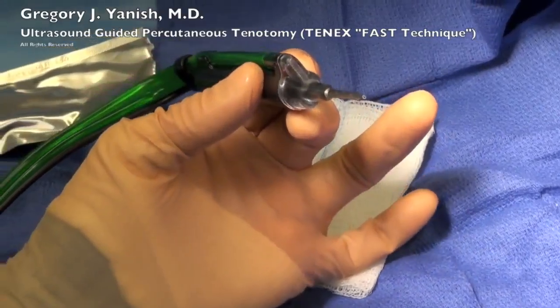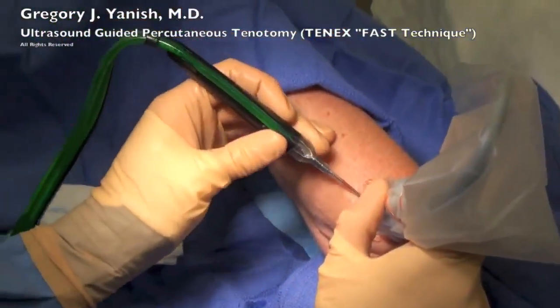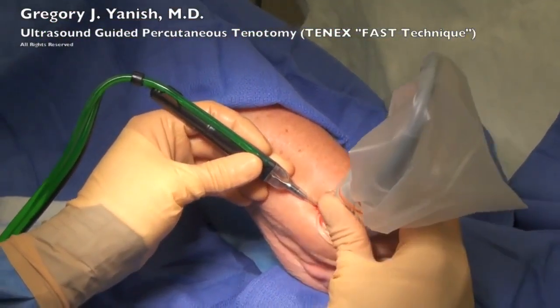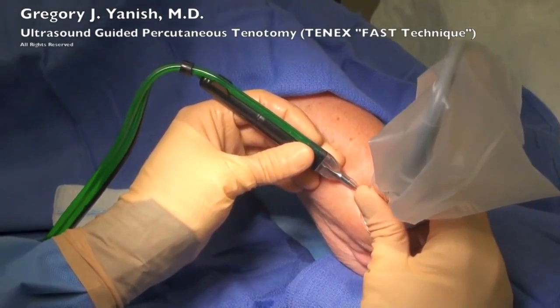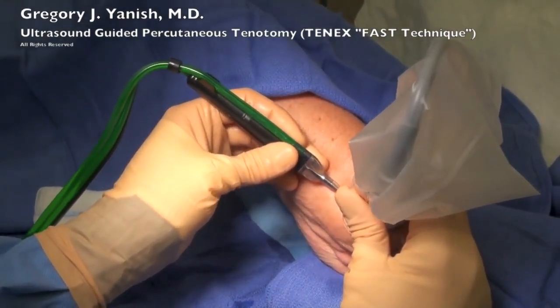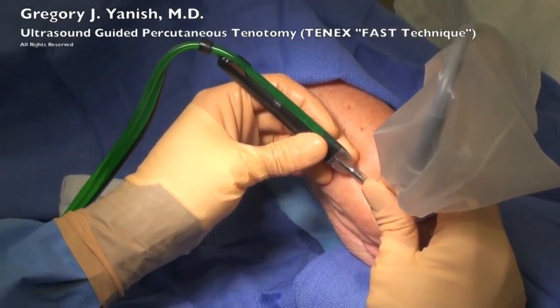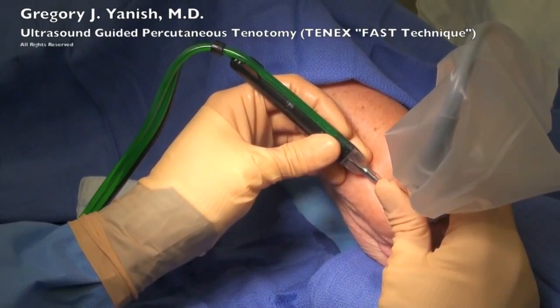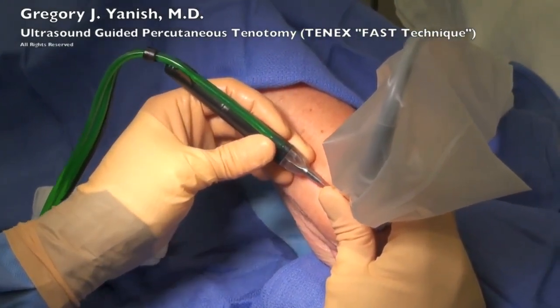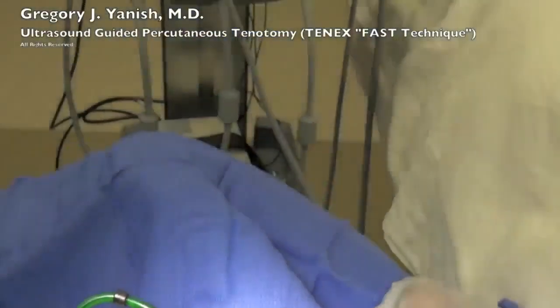This is the TX1 handpiece that I'll be using. It has a micro tip that actually performs the work of the surgery. This tip actually cuts and debrides the dead portion or the injured portion of the common extensor origin tendon. I'm using ultrasound here to position the tip of this instrument right into the area of injury. I also have a foot pedal below me that I'm using to activate the tip. This tip will use ultrasonic energy to cut, debride, and remove the dead portion of the tendon.